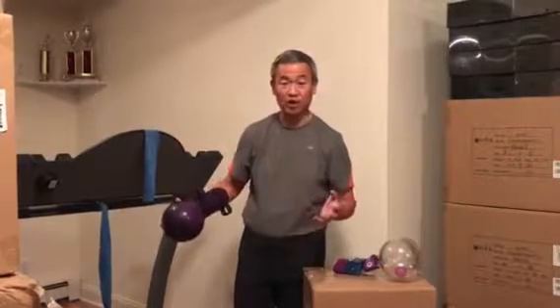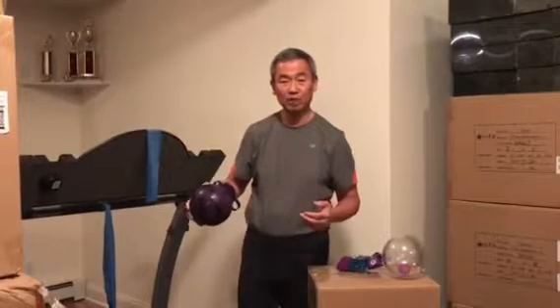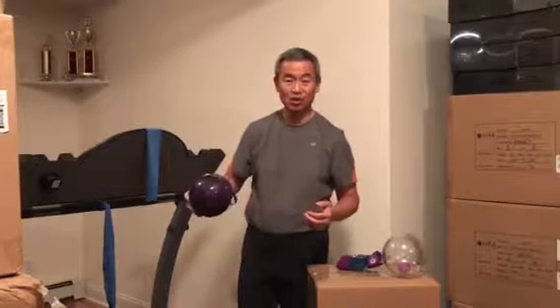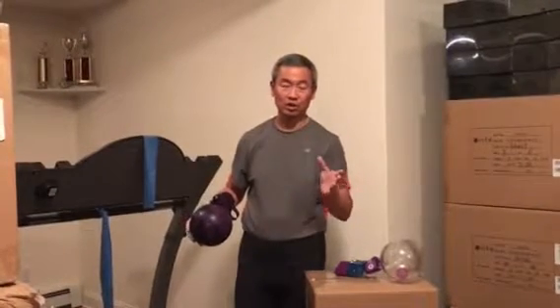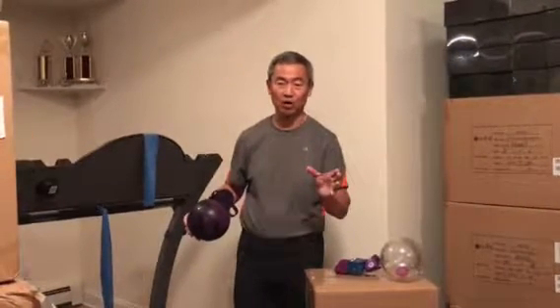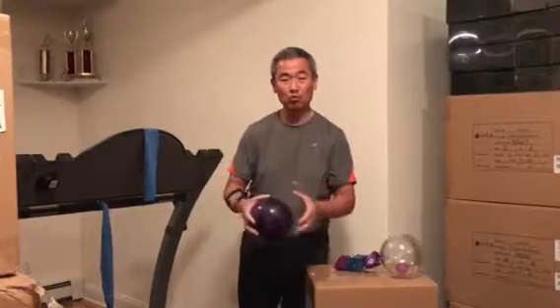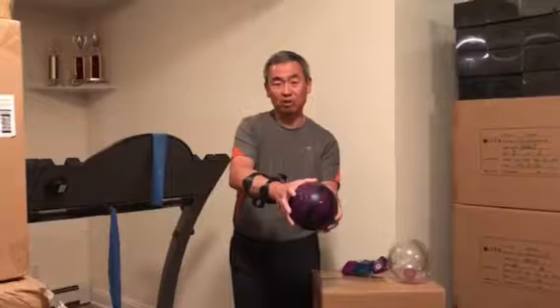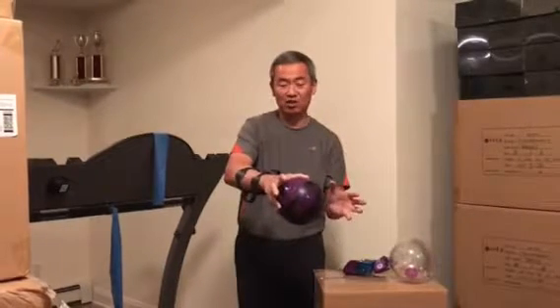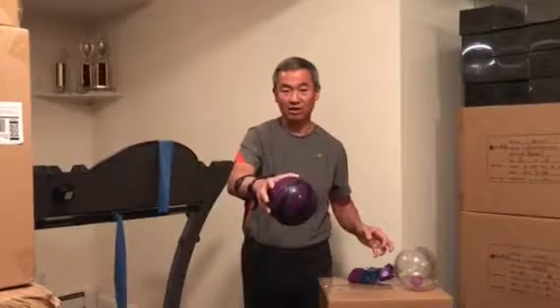And the subject would rotate the ball like this. So they can rotate the ball either fast or slow. Does not matter which direction. You can go clockwise or counterclockwise. As long as it's rotating, you are engaging the entire rotator cuff. The best way to hold on to the ball is one thumb pressure here, one little finger pressure here, and that controls the stability, and the person can just rotate it like this.